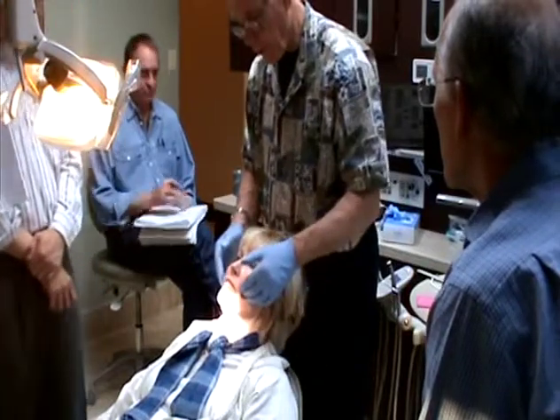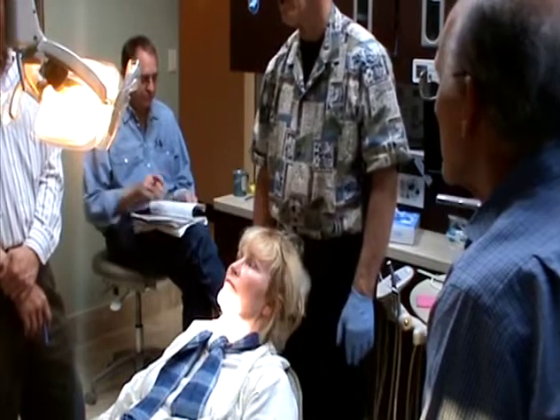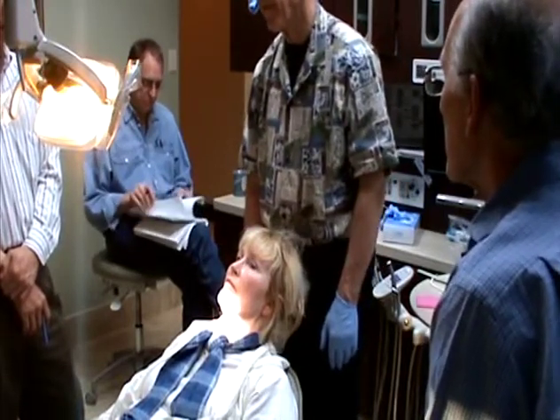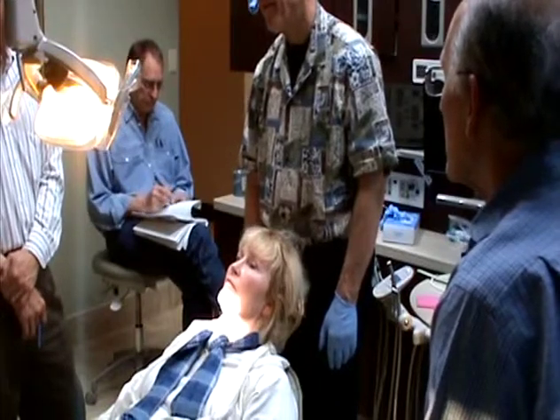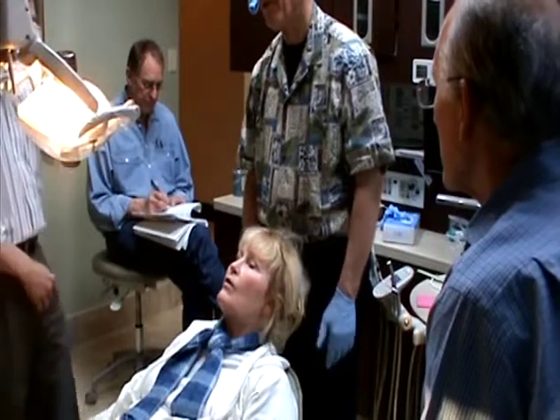And then, of course, when you do that, you're going to have to expand the lower too. So you need to do upper and lower in the same... You need to get that done, and you need to do a lower L. Do the upper first. Can you do both at the same time?